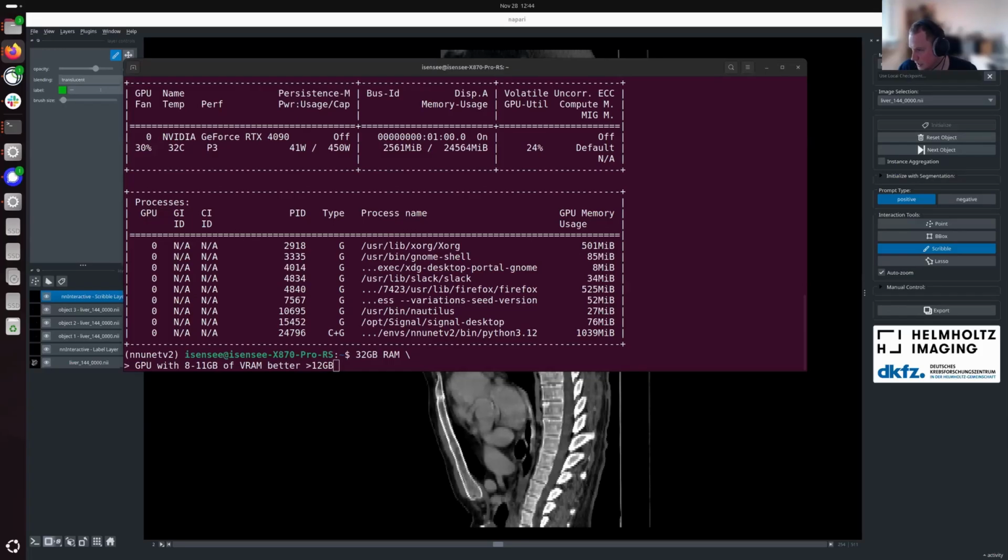Then there's a question by Arthur. We added 7 channels to the UNet, most of them binary images. Could you optimize it and put all binary masks into one int32 channel? What I didn't explain here is that we don't just put binary images into the UNet.